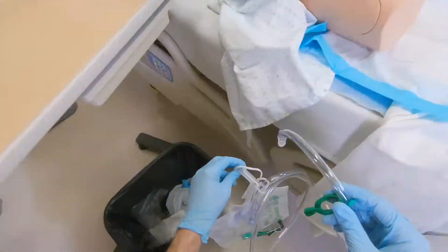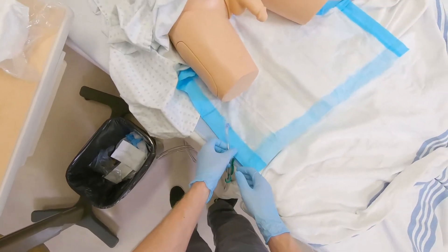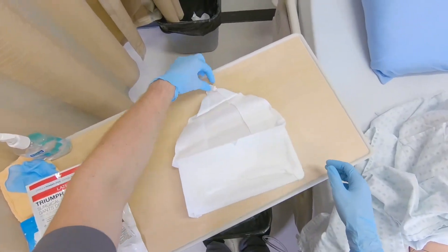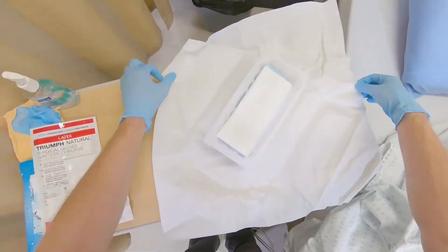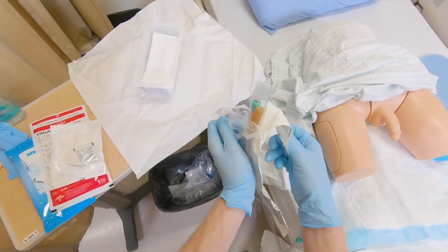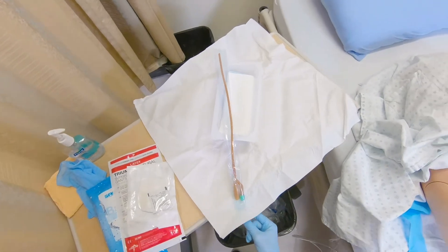Set up urine drainage bag and open sterile catheter kit. Peel back first layer of Foley catheter packaging and pinch catheter using underside of sterile field and slide off rest of packaging, letting catheter fall onto the sterile field.